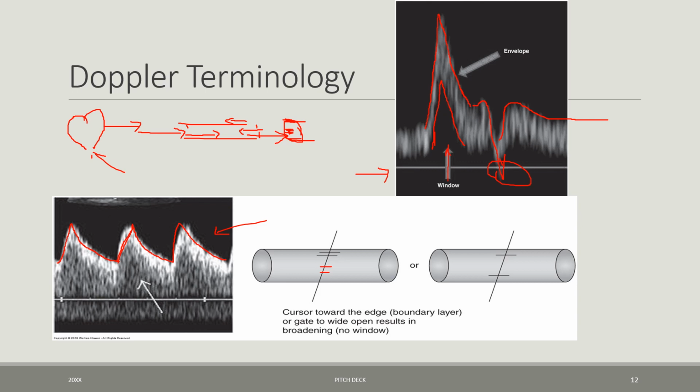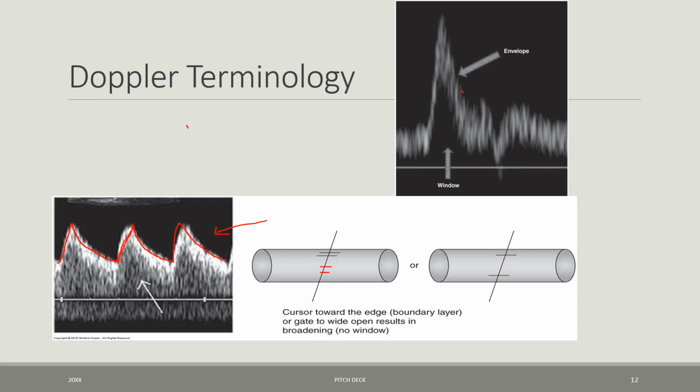If we look at what we're really seeing when we talk about these spectral waveforms and Doppler shift, we talked about how when sound comes in, our sound wave will come in, and if it interacts with something moving toward it, it's going to crash in there and come back at a higher frequency. My system's going to detect a positive Doppler shift that says something from this area was moving forward. Now, if I were to take that information, my system with a spectral Doppler is simply plotting that on a graph. So it would say, ooh, I got forward motion of this speed here.